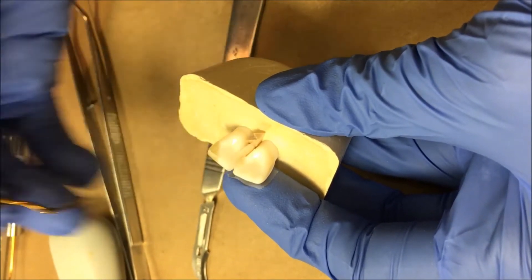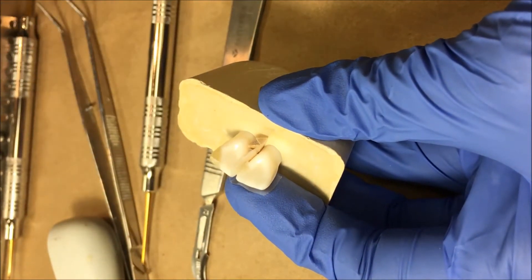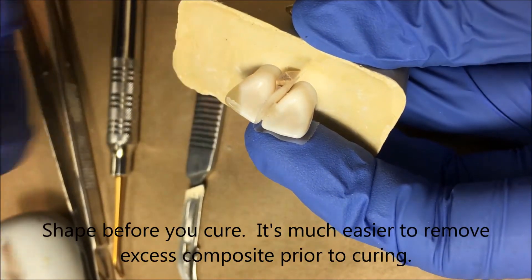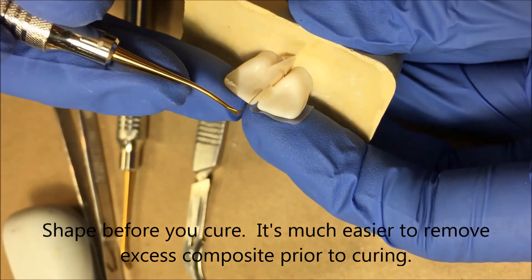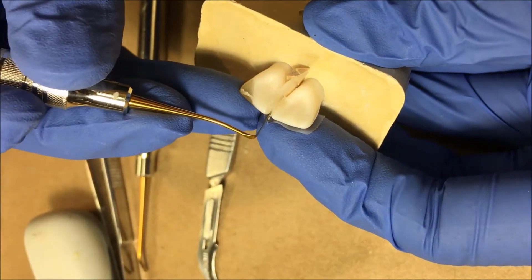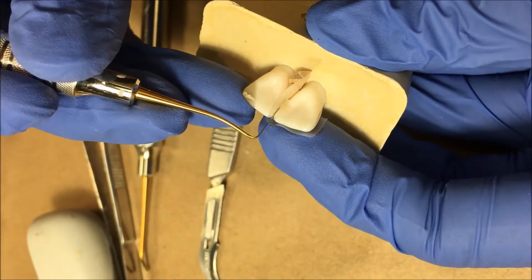Remember when I told you not to rush on this? This makes a big difference. I can also use a thinner bladed instrument as well and I can actually start creating just a little bit of my embrasure. Remember that one of the places you tend to get a lot of flash is at that incisal edge.